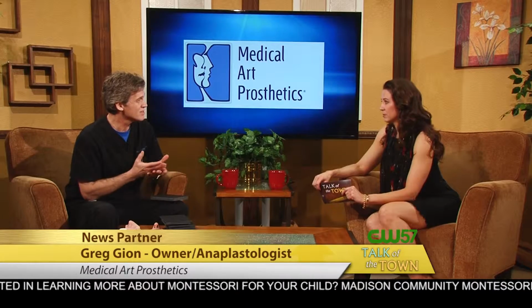Really amazing. What are some of the reasons that folks might need one of these? The main reason, I'd say in my practice, probably close to 75 to 90% of the practice, is cancer. People have had some sort of a basal cell or squamous cell carcinoma, and they've had their tissue removed, part or all of their nose. Another reason would be car accidents, any kind of a motor vehicle accident or trauma. Gunshots, dog bites, there's a lot of different things that can happen, or even substance abuse. I'm actually familiar with someone that does have the cancer situation. So thank goodness you're here doing this. This is life-changing for folks.